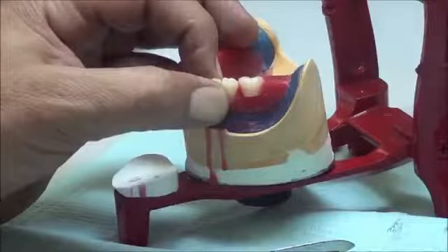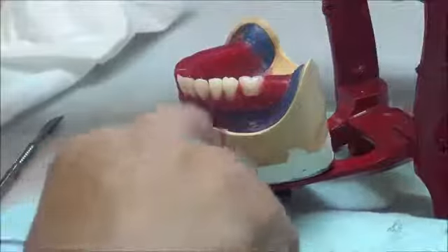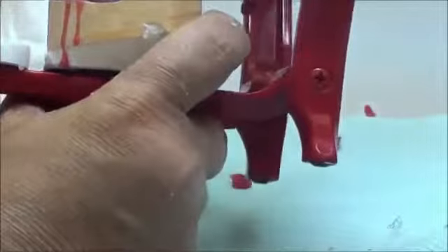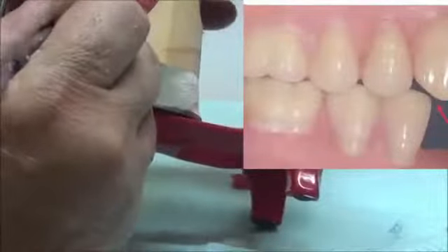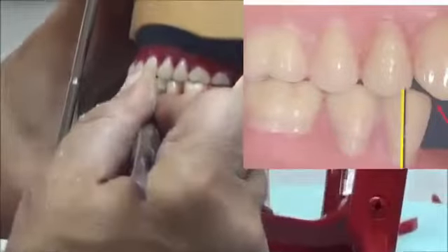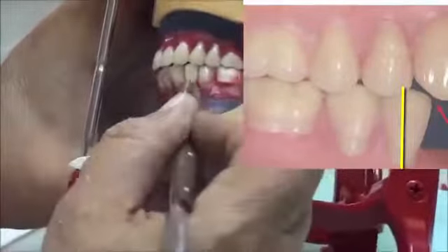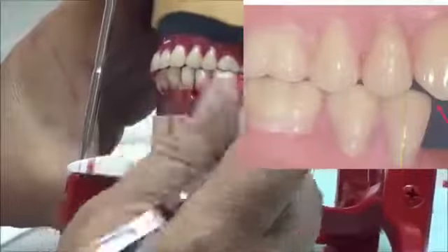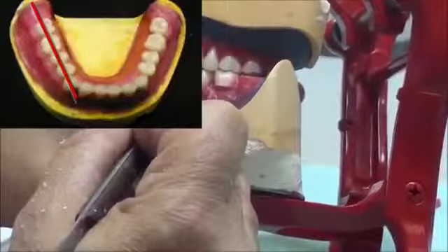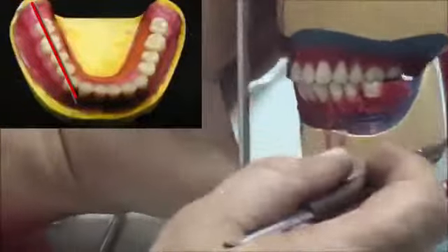How do you know it's fit in place? Once we close the articulator, we want to make sure that it fits with the upper without any space between the posterior teeth. So it went into place, and we are trying to orient the roots of the premolars of the lower so they are also upright as they were in the upper. Like at tooth number 6 there is no space, tooth number 5 is in contact with no space. So that makes sure that we have added the tooth in the correct position. And we slightly rotate it to meet the canine. So it meets the canine.